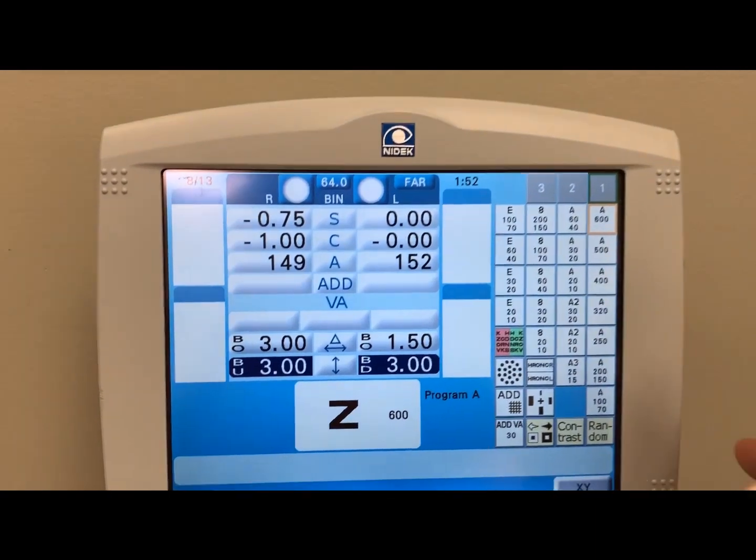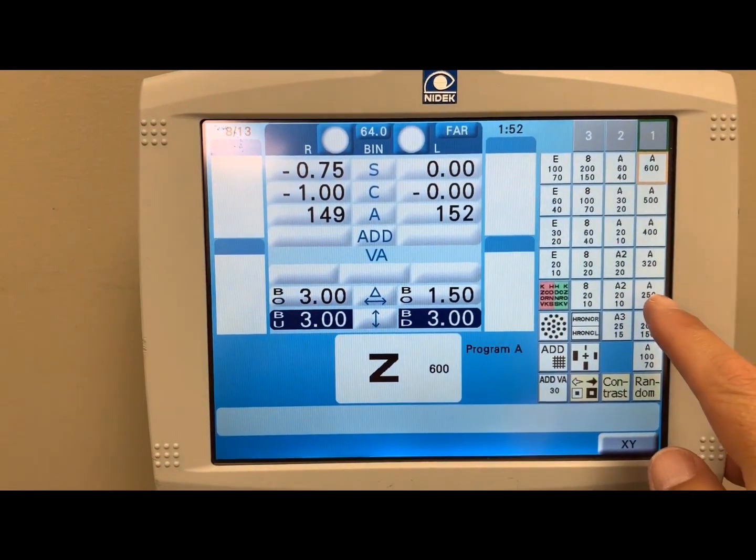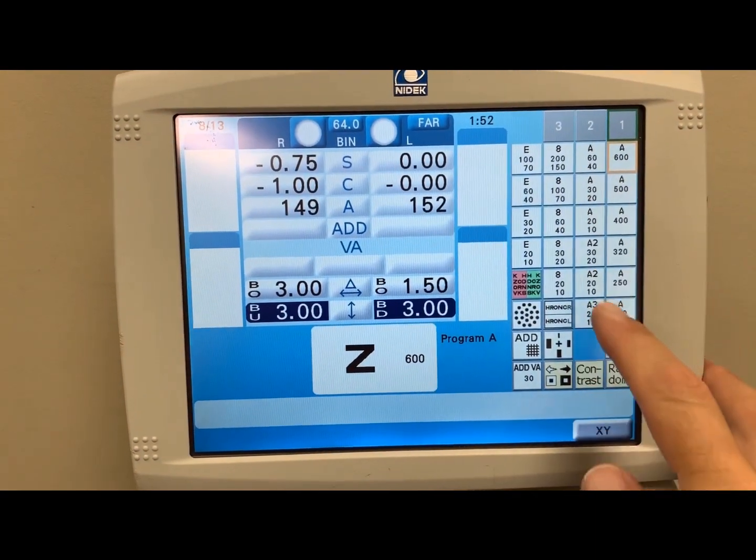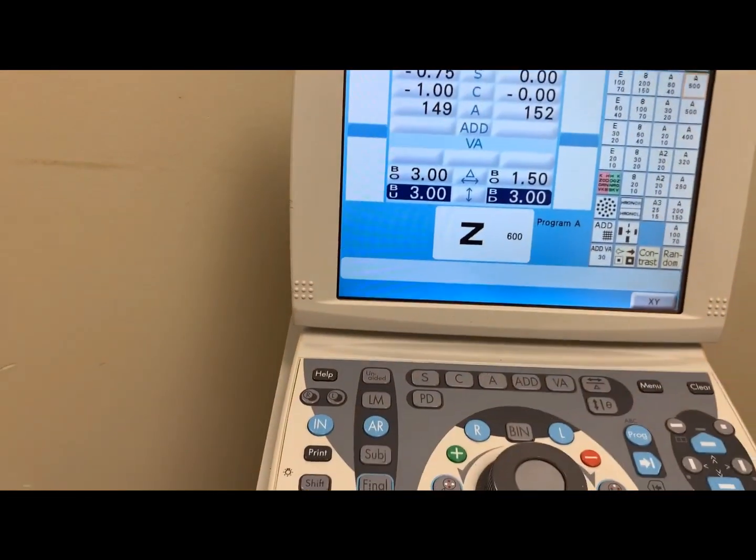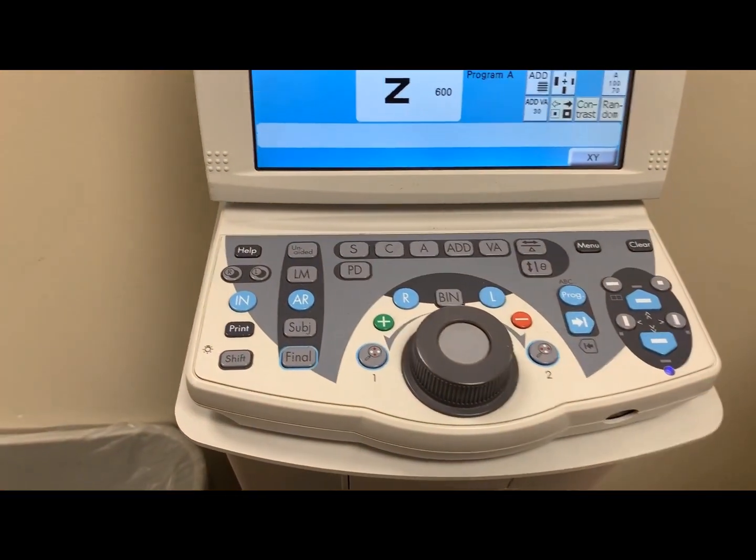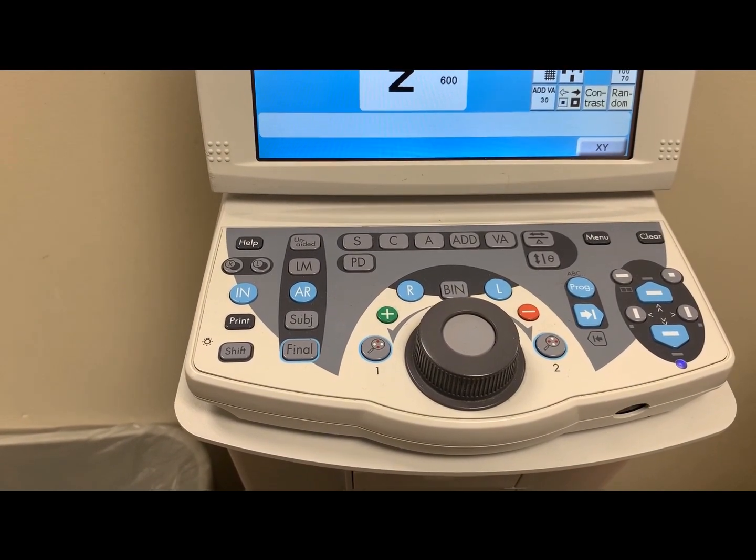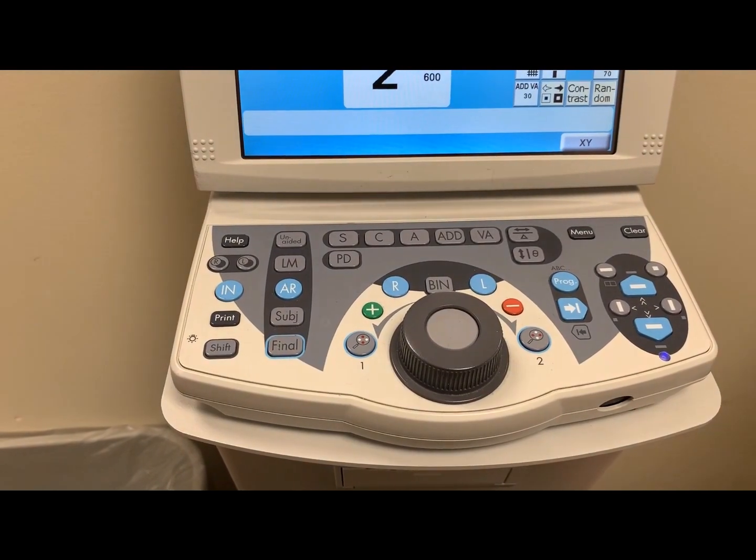Changing the eye chart on this particular instrument will be located here on the side. You can simply select which one you want to change the chart to. And that concludes the very brief tutorial and introduction on the Marco slash NIDEC system.